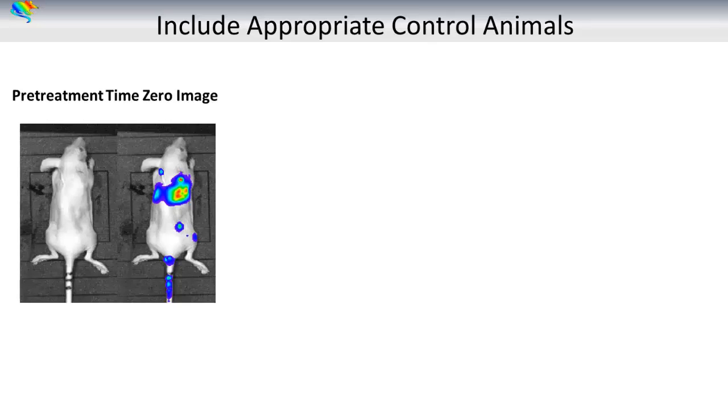With bioluminescence, we strongly recommend to take a time-zero image of the subject with and without D-luciferin. Not only does this eliminate potentially contaminated animals, such as contamination with bioluminescent bacteria or radioisotopes or dirty bedding phosphorescence, but it will also allow you to measure the basal level of autoluminescence in your ROI, facilitating longitudinal measurements of increase or decrease of photon flux over time, as animals do not exhibit an absolute zero.